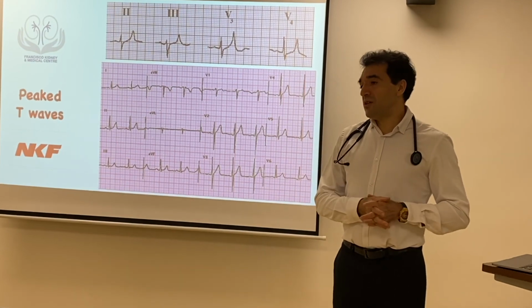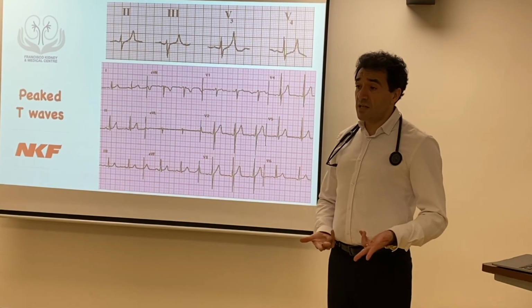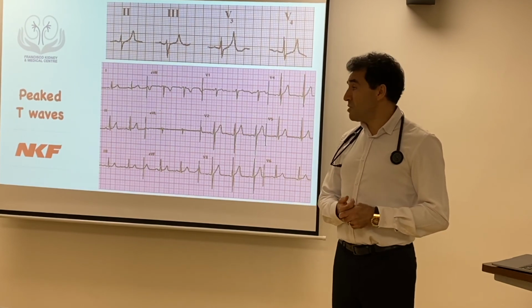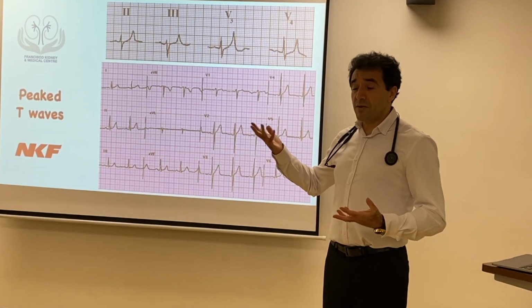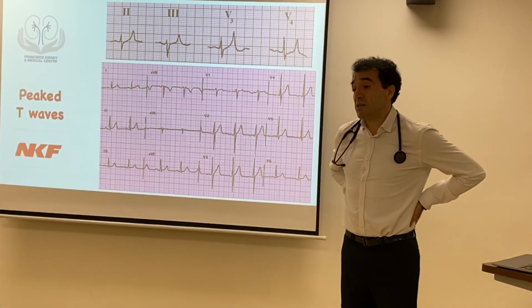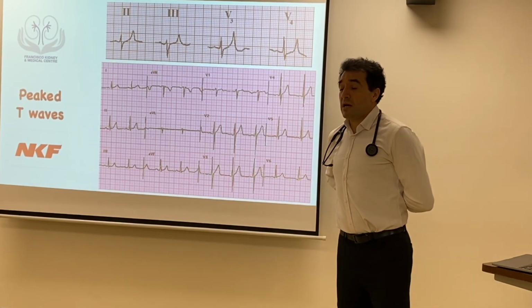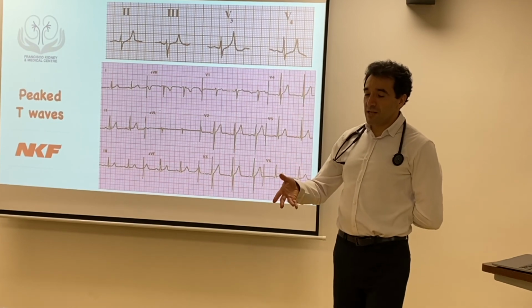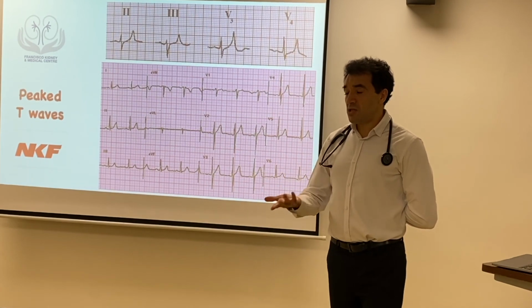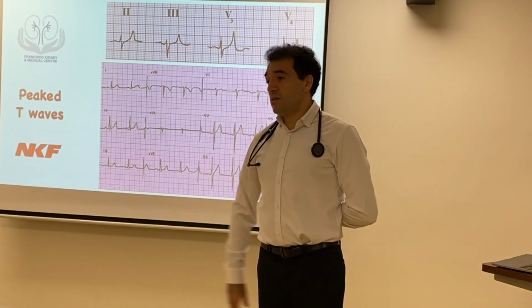But I think the doctor did right. Check the ECG and then confirm if it's bradycardic, if there are some complexes or any arrhythmia that requires something else. You confirm the heart rate is better, there is nothing major, so the doctor said proceed, yeah. So I think it was okay, but the discrepancy is probably because it's different methods, etc. And it could have been at different times, because you might have done the ECG a little bit later, maybe the clinical situation changed. Maybe it was real that it was 40 and suddenly now it normalized a little bit, no?